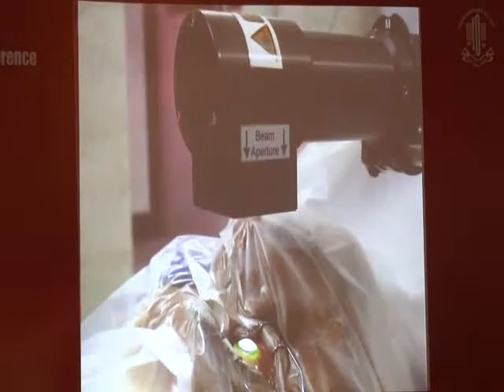If we look at the procedure itself, it is best to perform this in the operating room because there are increasing reports of infections after this procedure, and this is perhaps not surprising considering that we create a fairly large corneal epithelial defect and we leave it exposed for significant amounts of time.